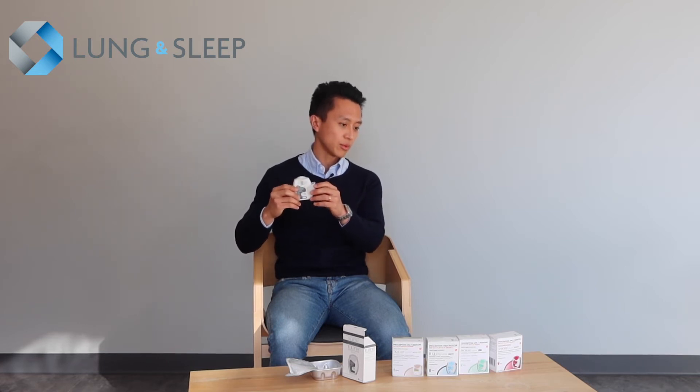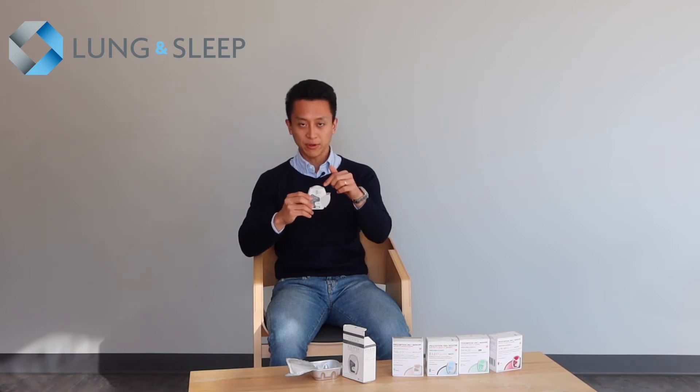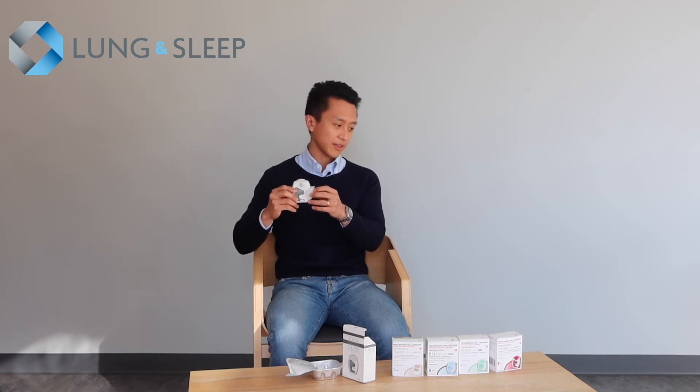Exhale away from the device, put your lips around the nozzle and form a tight seal. Take a deep and steady breath in, and hold your breath for five seconds. You then exhale and flip the lid back on.